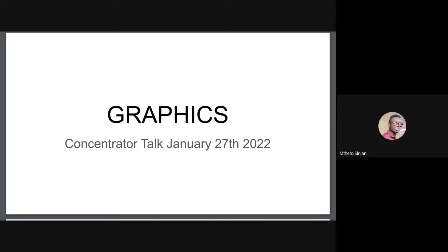The other type of zeolite is called lithium-based zeolite, also known as LiX. This is generally a more expensive type of zeolite and has higher adsorption of nitrogen, leading to better performance in comparison to the 13X you have. With the model of concentrator you're working on, the manufacturer uses lithium-based zeolite to achieve great results at maximum flow level. So despite having a pack of new 13X zeolite and following proper procedures, that might not solve the problem of that concentrator.